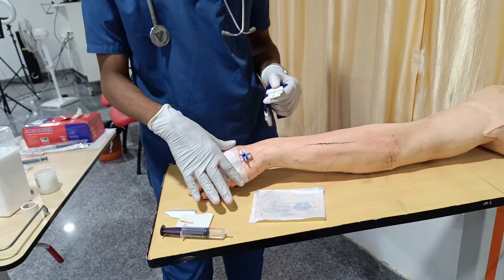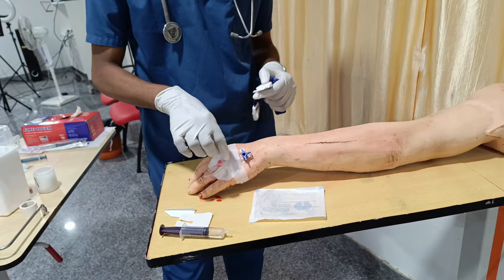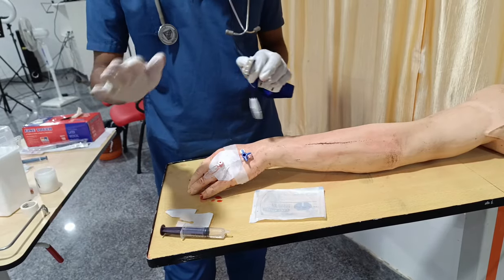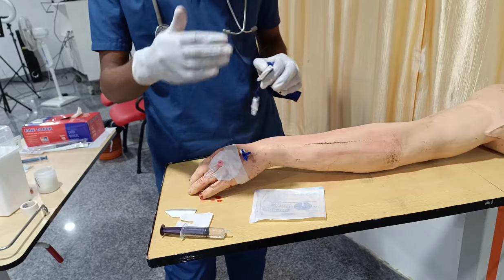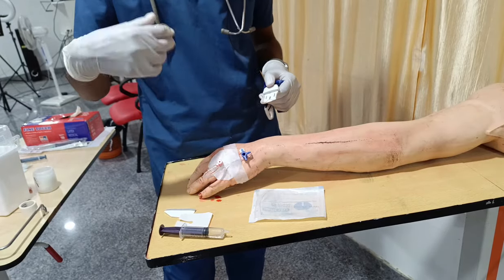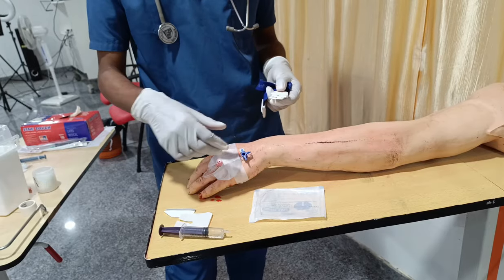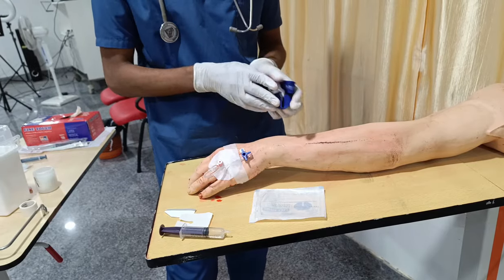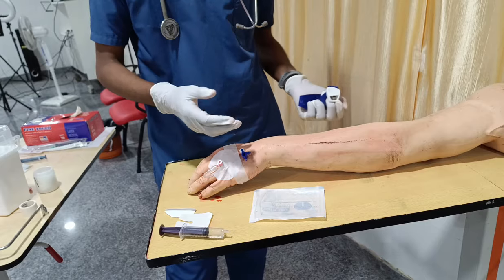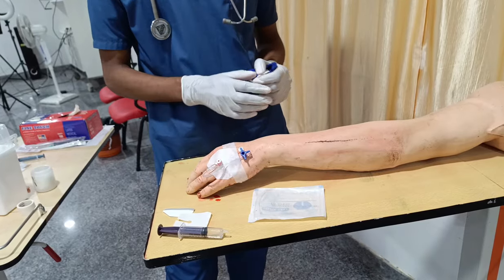So we fix the catheter. Before fixing everything, once you place the catheter, make sure it is inside the vein itself. Before giving the flush, you have to remove the tourniquet. That is one point you have to add: remove the tourniquet, then flush the line, and then anchor the catheter.